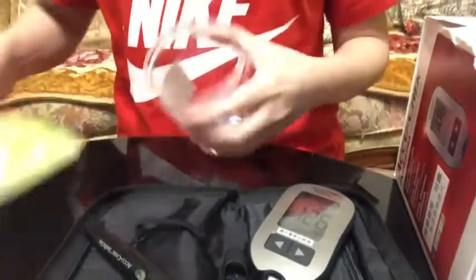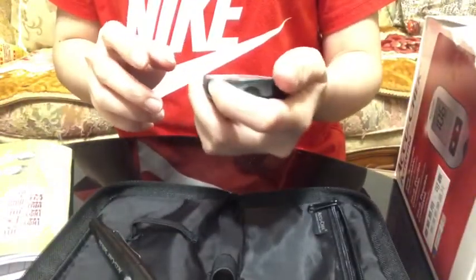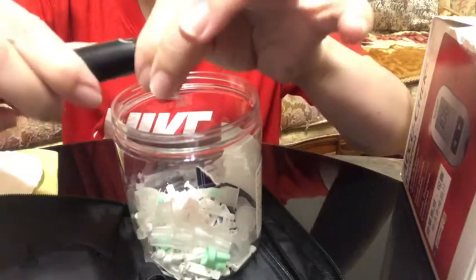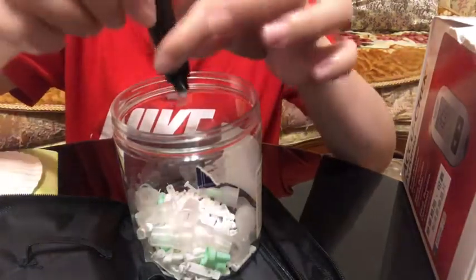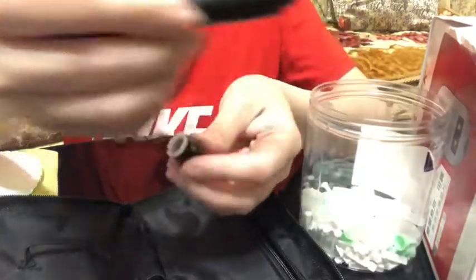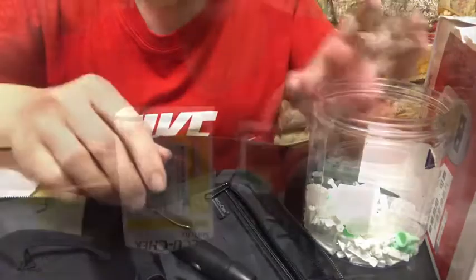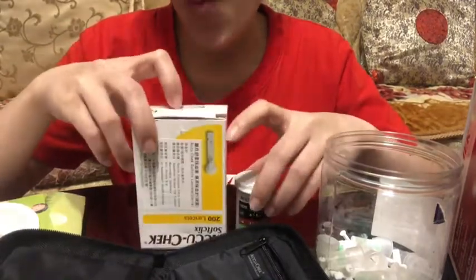Get a sharps container. Remove the used lancet, then remove the cap. Point the lancing device to the container and slide forward to eject the lancet. Then place the cap back onto the lancing device. Remember, lancets and test strips are disposable and should only be used one time.